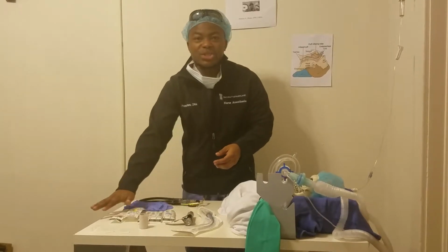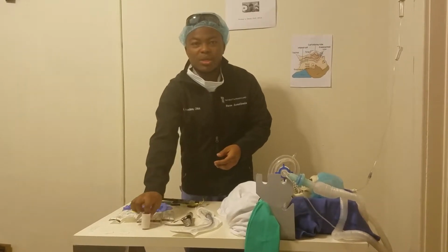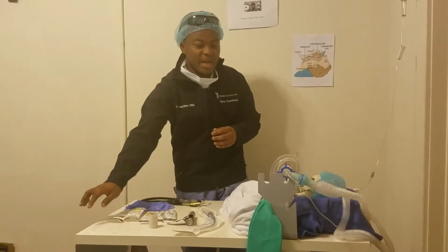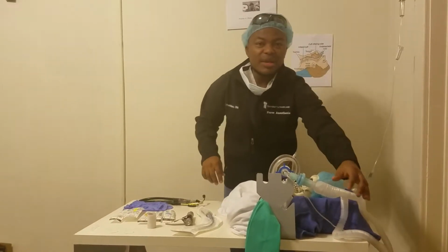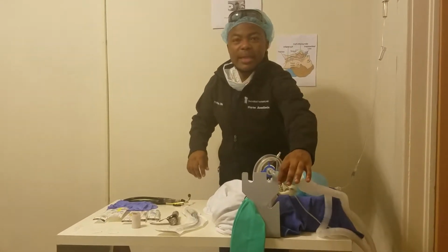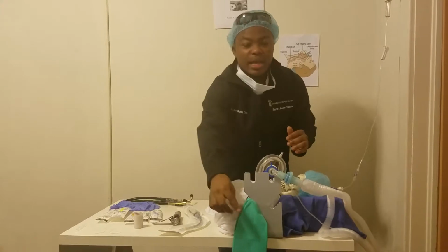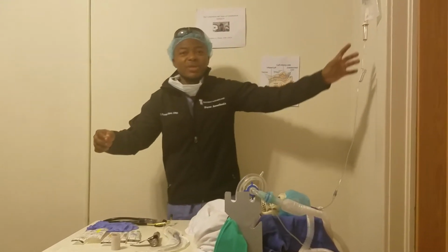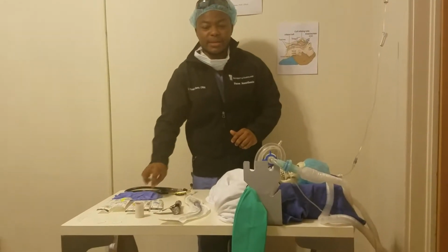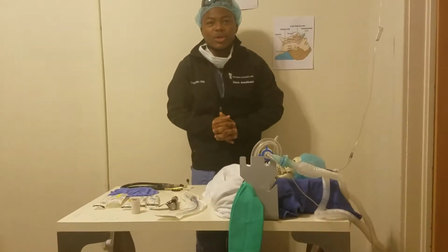We have our medications here, which we will mention: some tape, Tegaderm for the eyes, some lubrication for the eyes. We have our circuit here connected to an oxygen source. We have a mask, end-tidal CO2 monitoring, a bag mask, an IV setup, and we have a stethoscope and some gloves at the end. So, we continue.